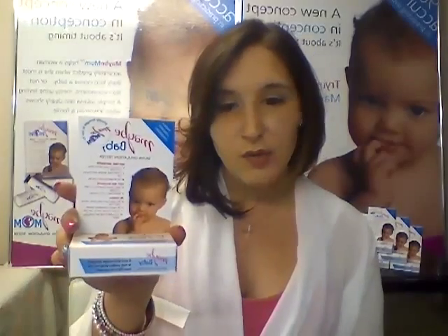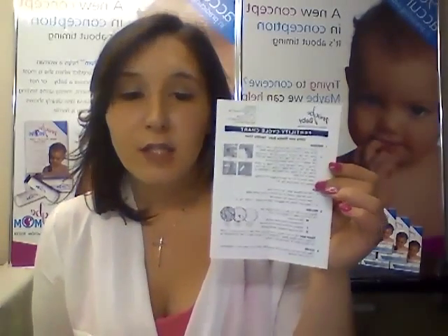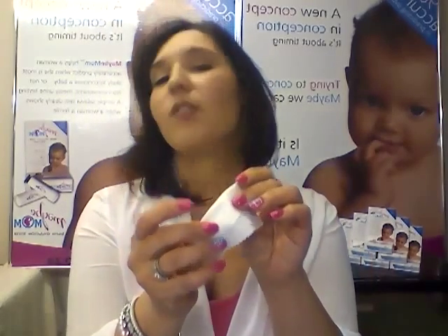I'm going to show you how simple it is to use and what a powerful tool this can be when you're trying to fall pregnant. This is what it looks like in stores. In your box, you will get your instruction leaflet on how to use it and you will get a fertility chart. You get your microscope, which you can use up to 10,000 times — no need to throw it away. And you get a soft lint cloth that you use to clean your microscope lens after each use.